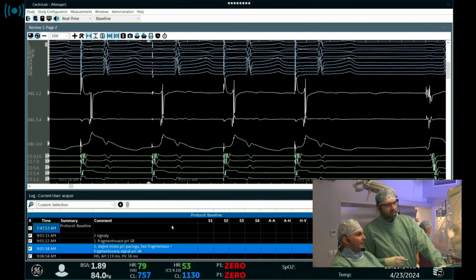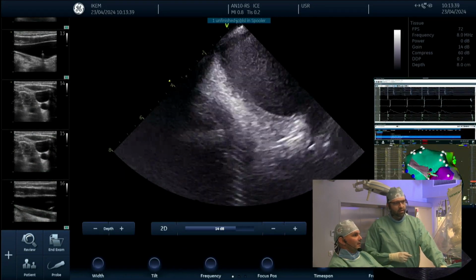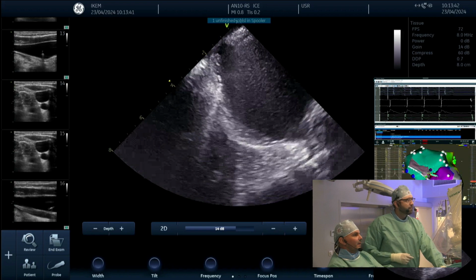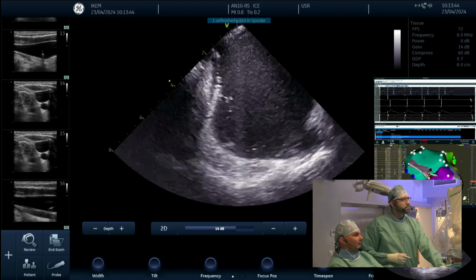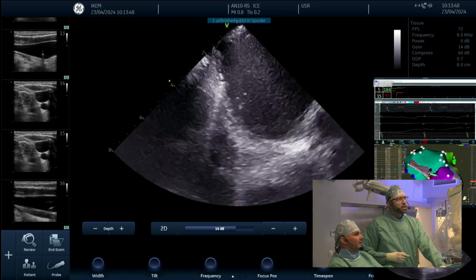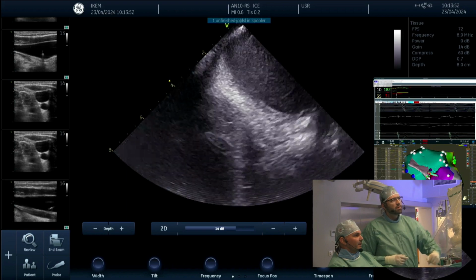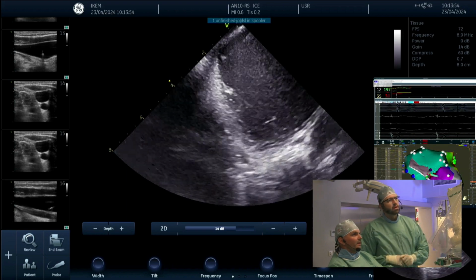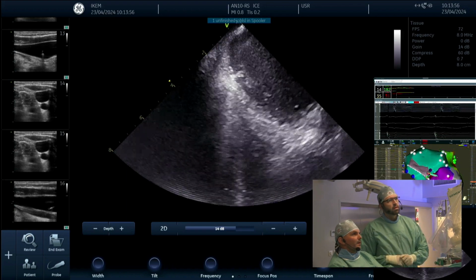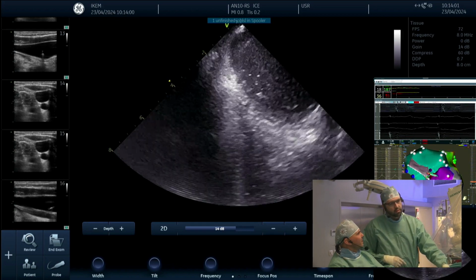But you can use extra cardiac vagal stimulation as the identification, because if you ablate and you completely abolish the response, you probably destroyed the GP. So you don't need to search with high frequency stimulation for GPs, but you can check with high frequency stimulation in this vagus area, as shown nicely.